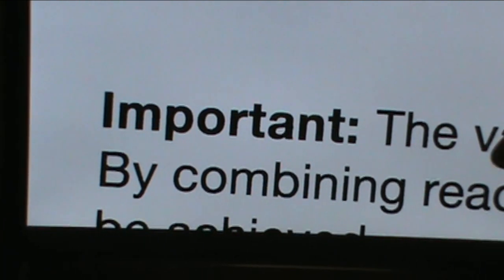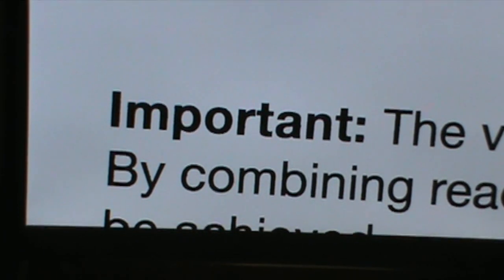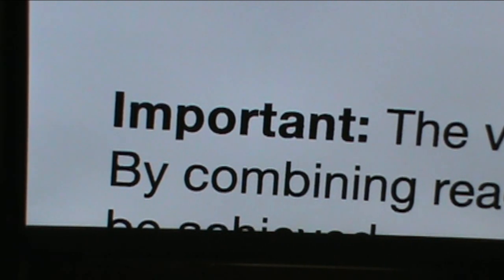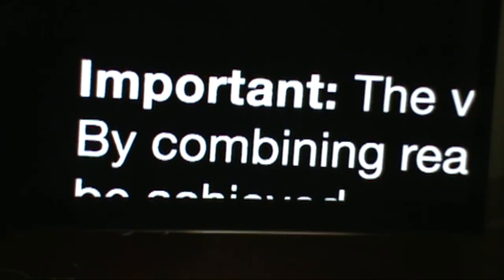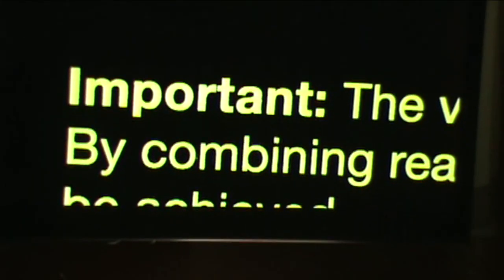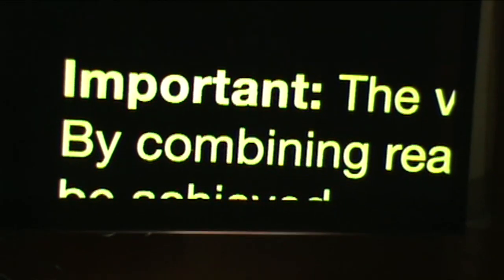Let's talk about enhanced print, which we started earlier. This machine allows us to choose colors so that we can see print better. Some people like yellow text on a black background. That, of course, is possible, and I have that as a color choice here. There's our yellow text on a black background. And again, we can choose that.